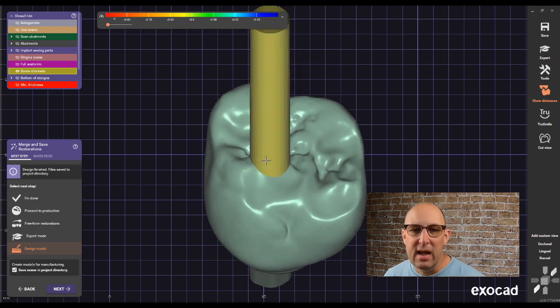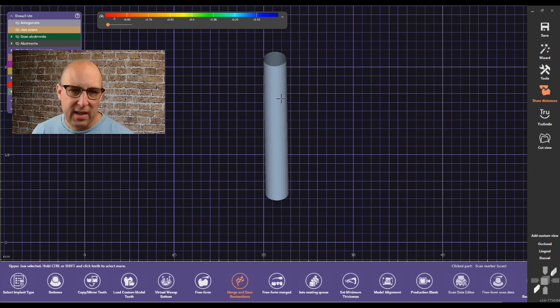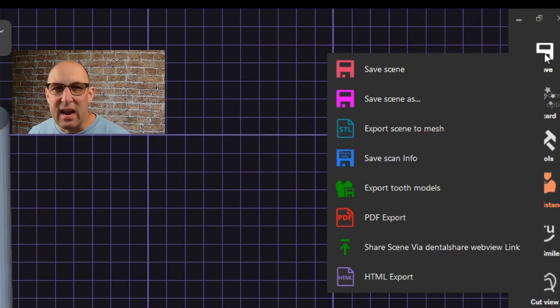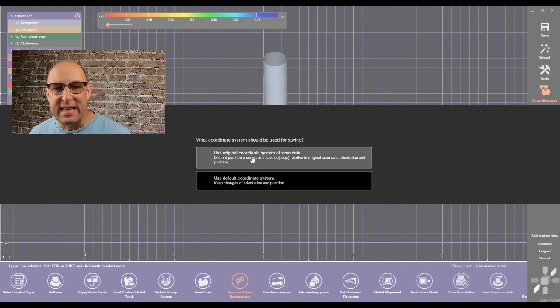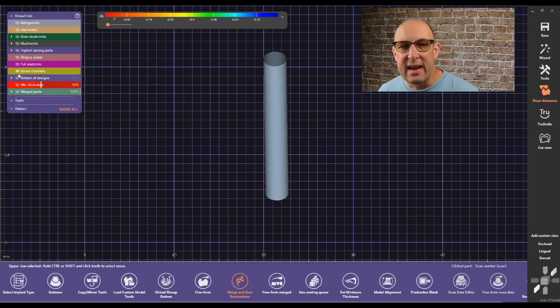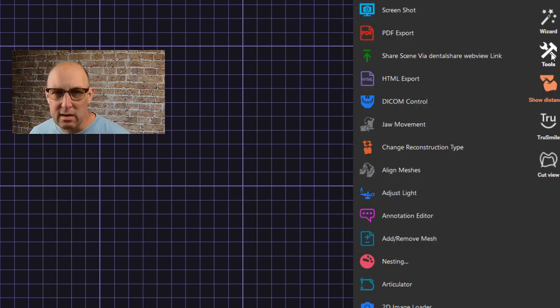So once we have our crown with the screw channel, the first thing we're going to do is isolate the screw channel. Once isolated, save it out as an STL file — only the screw channel, nothing else. I'll name it 'screw channel' for better naming purposes so I can import it later. Click yes and use the original coordinate system.